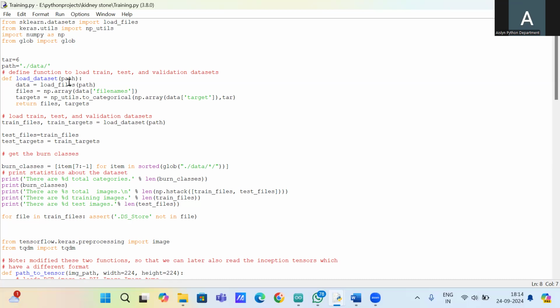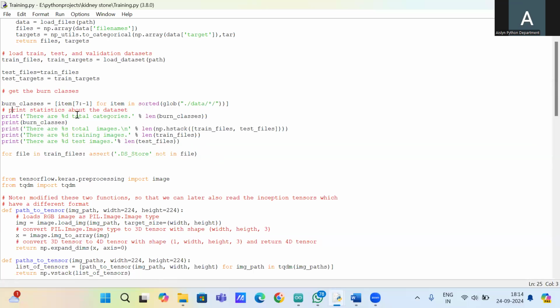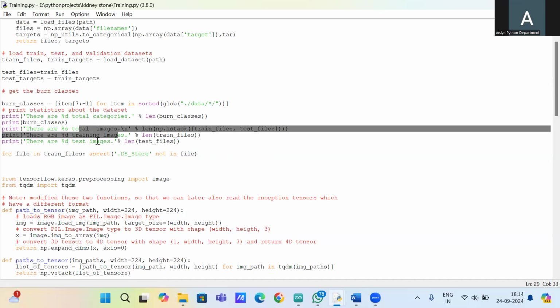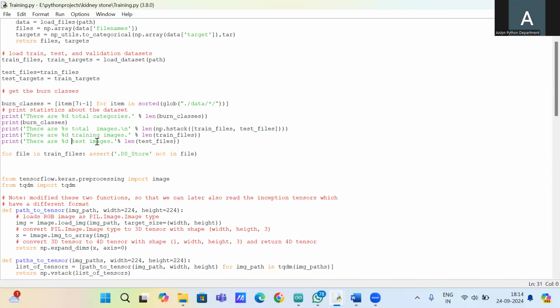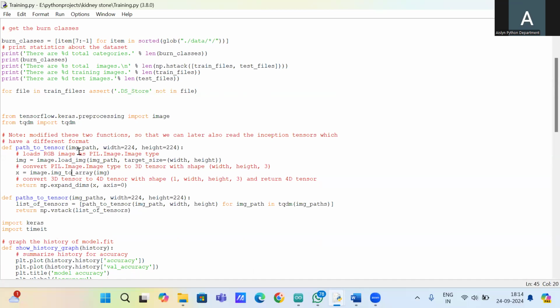Here we will load our dataset path, and it will extract the file names and the targets. File name is nothing but the names of the files. Here we will encode the targets, that is, the image labels. Then we do the encoding here and it will return files and targets to load the dataset. And then our data will be separated into training files and test files. And these are the statistics of the dataset. Here it will print total categories in the dataset, and total images in the training files and test files. And then here you will convert your 3D image to 4D image.